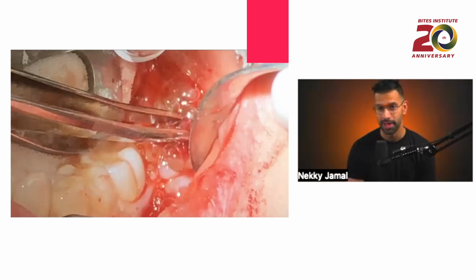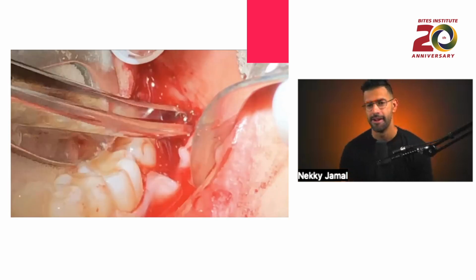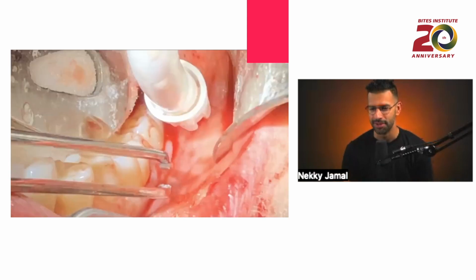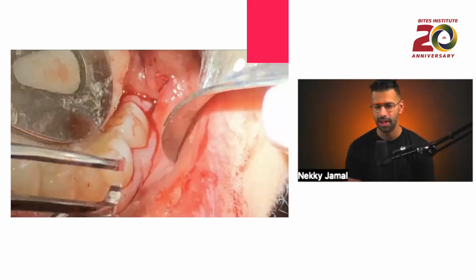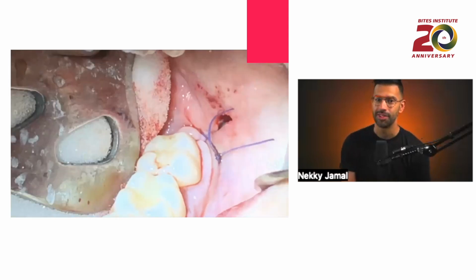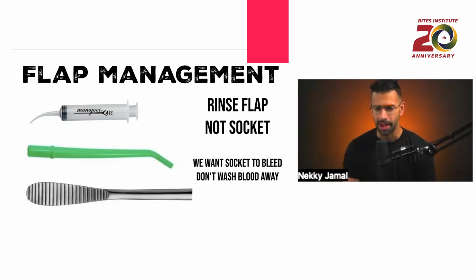I always put PRF in my extraction sockets, but being a part of Bites, I used to teach that for years with you guys. So PRF is huge. And then we tie the suture there. Okay. So we never rinse the socket. Okay. I always rinse the flap.